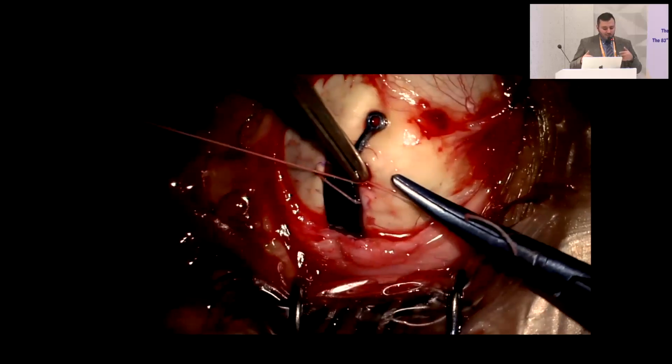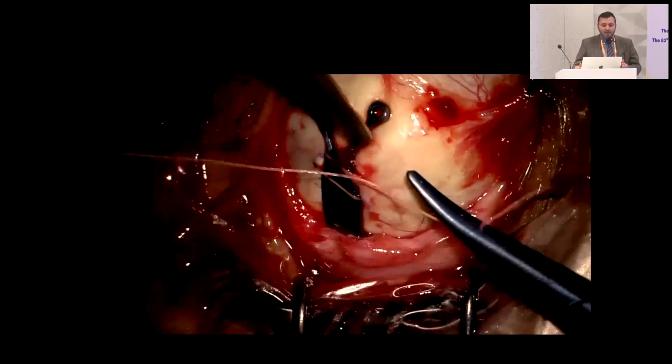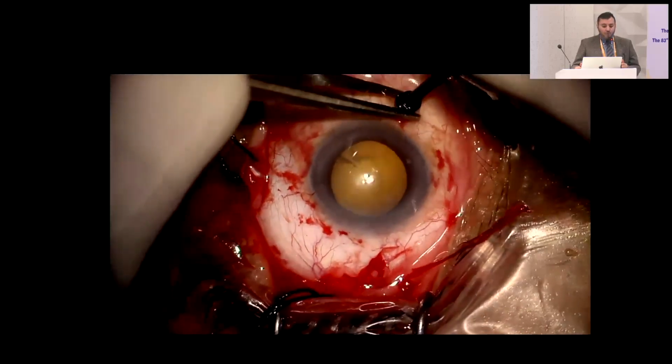It doesn't need a long learning curve from the surgeon, but it needs to be oriented with the anatomy of the posterior pole and the posterior staphyloma.